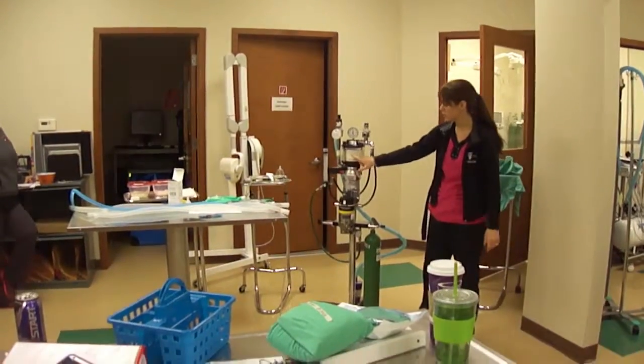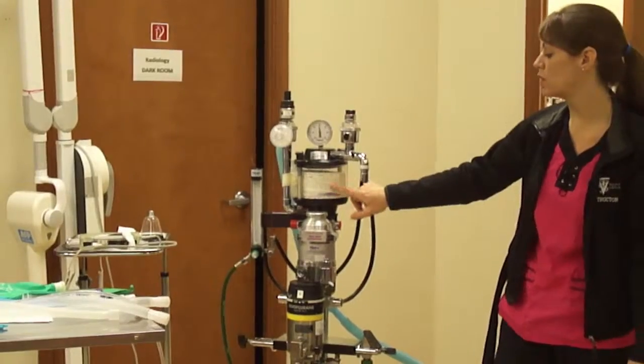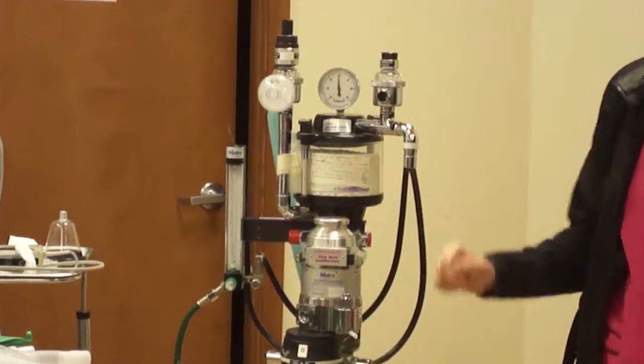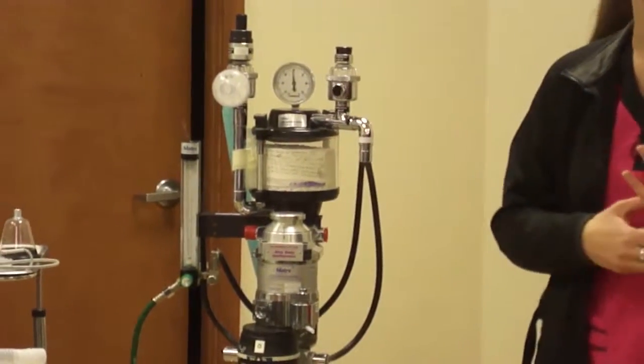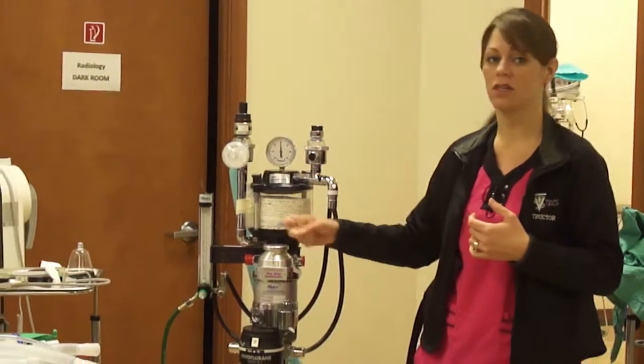Canister, you can see they have a piece of tape on here. So at the end of the day, what we're going to do is go around and check with everybody that was the monitor for patients, and we're going to add up the total amount of time that the patients were on this machine.